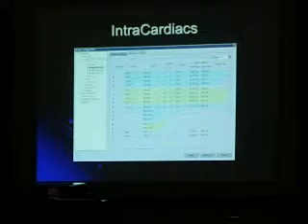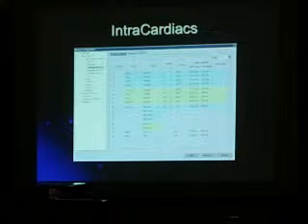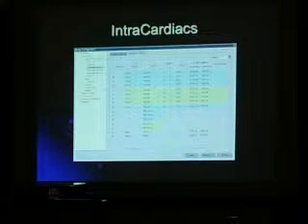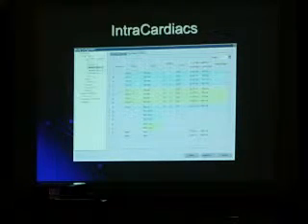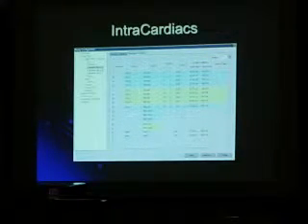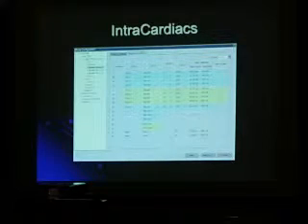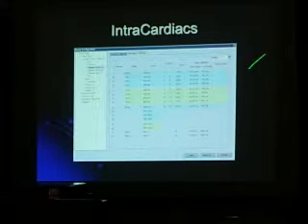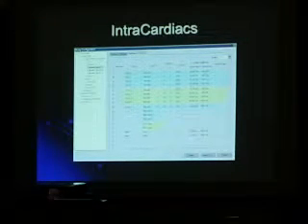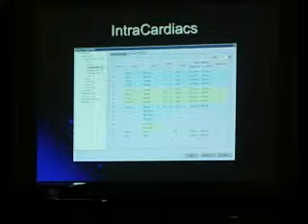My only concern, and I've been trying to work with some of our research people in a couple of our research centers that work with our equipment, is that I'd like to build a bank and record what the actual frequency, what the speed is of various types of tissue and whether they're healthy or not, so we can really design filters that work really well. Pulmonary vein potentials, I know they're fast, just don't know how fast. So this might interfere with that. And the reason I say it might is because I have no data to say otherwise.